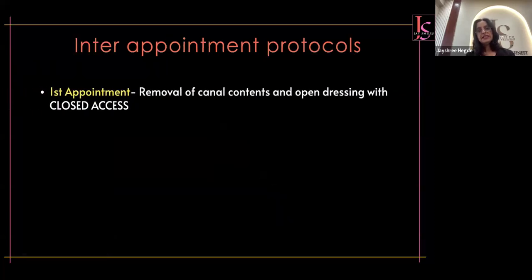So in the first appointment, we remove the GP and I give what is called an open dressing. Open dressing is not what you all think, where there is no access filling at all. Open dressing for me is no intracanal medicament in that particular root canal. You still close the access opening, but your canals are open for drainage. So you don't want saliva to get into the root canal and complicate your root canal, resulting in failure. You want to close the access opening, but you keep the canals open.